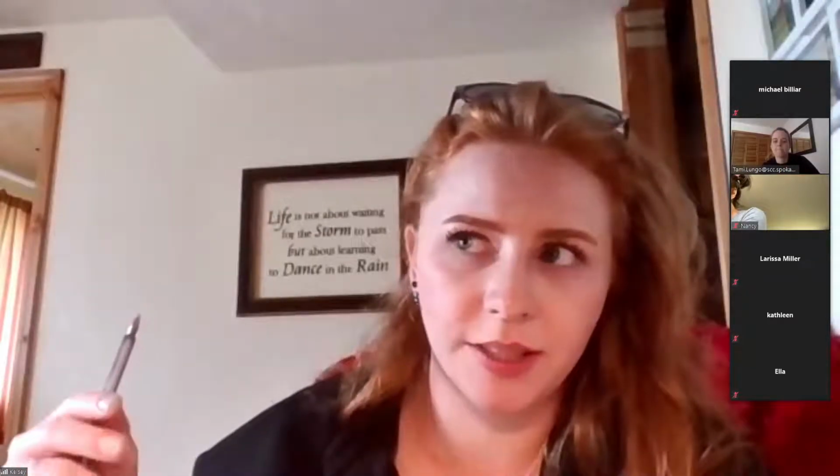Yeah, I think he mentioned the angle correction because it's coming in at a different angle versus the straight up and down angle that you would be able to get with the pulsed wave there at the right lower. I move the heart, like I put that heart anywhere I want on that screen. And before I go into an angle correction, I'll just swing the heart and line it up differently. Or, if you wanted, you could Doppler that right upper from the subcostal kind of by bicaval. It's always there too.